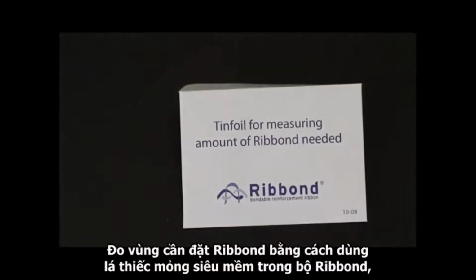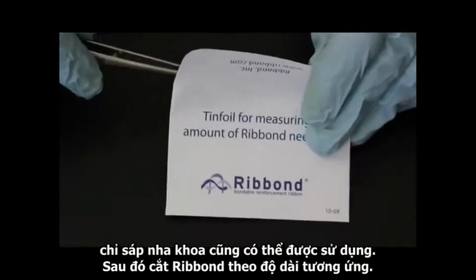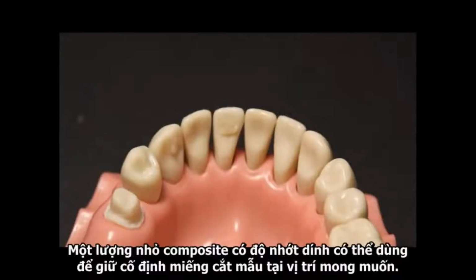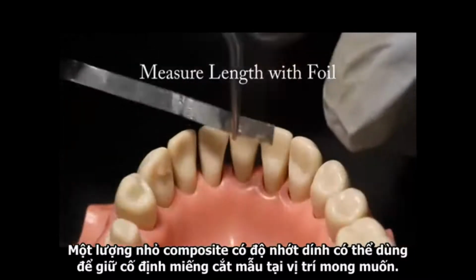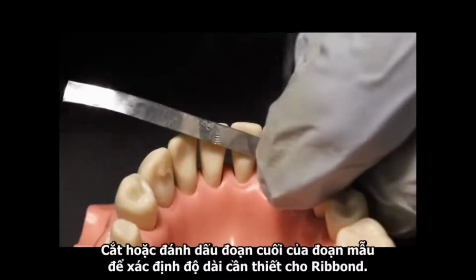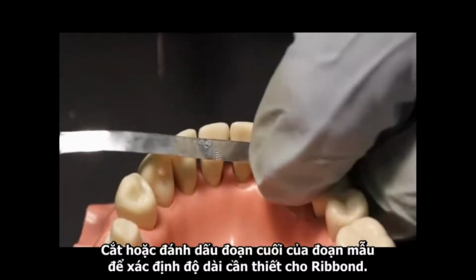Measure the area where the ribbon will be placed using the dead soft tin foil provided in the ribbon kit. Wax dental floss can also be used as well. A small amount of tacky viscosity composite can be used on every other tooth to help hold the template in position. Adapt the tin foil or dental floss to the teeth as you would adapt the ribbon. Cut or mark the end of the template to indicate the length that will be needed to cut the ribbon.